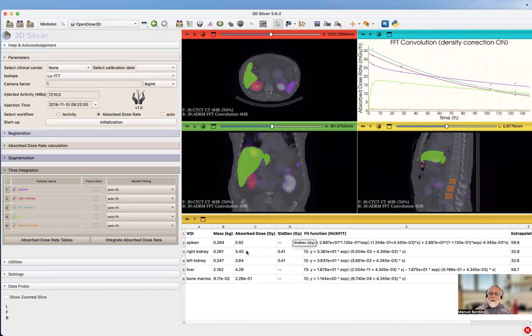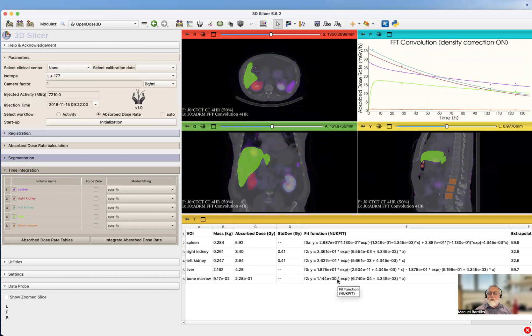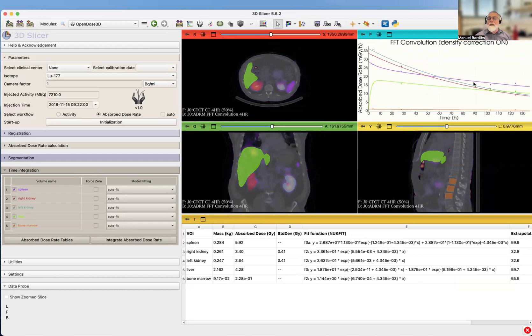The result is the list of volume of interest, the mass of the volume of interest, the absorbed dose in gray in the volume of interest. The standard deviation is the standard deviation on the fit, based on the fit. When you have a value, it's because it passed quality criteria. If you don't, then it didn't. Here you have a fit function that's been used using the Nuke fit approach. The last column is the percentage of extrapolation on the curve, what has been extrapolated after the last time point.